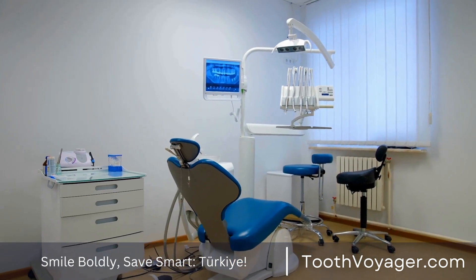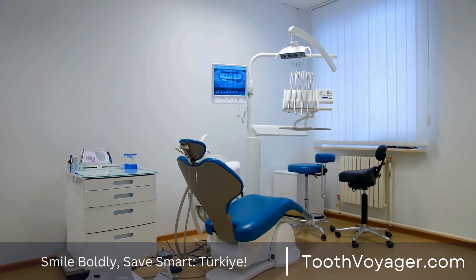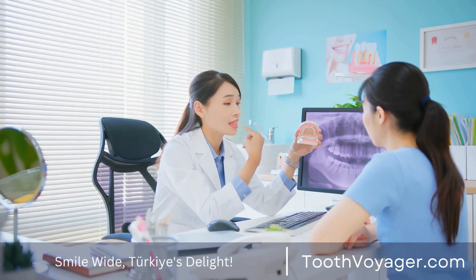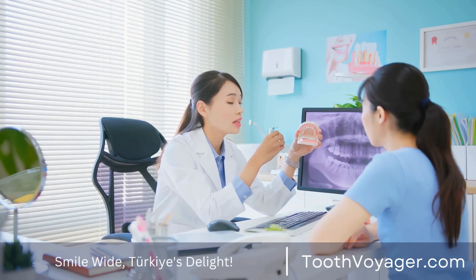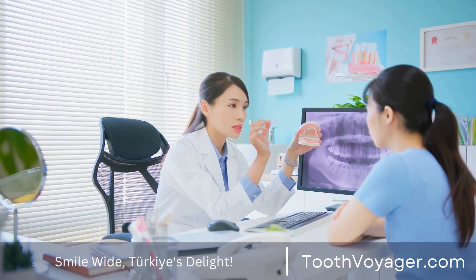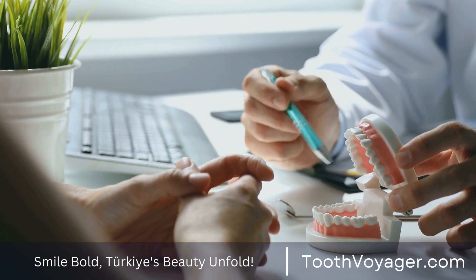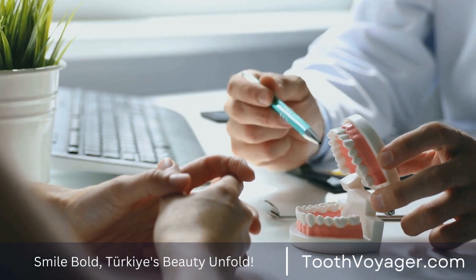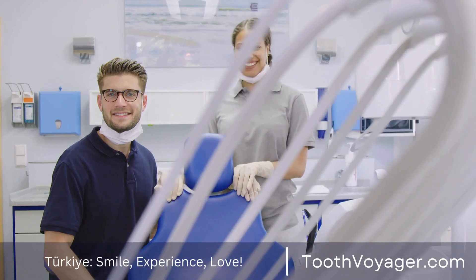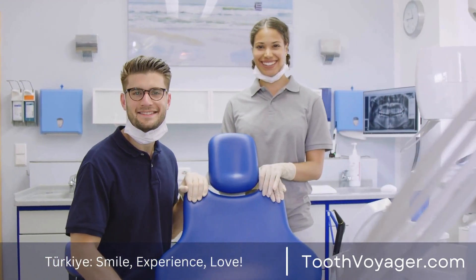The procedure of grafting bone for implant dentistry begins by conducting an extensive examination and analysis of the patient's oral health, as well as the jawbone's anatomy. When it's determined that it is needed, the dentist can discuss the different kinds of bone grafts available as well as the ideal option that best suits the individual patient's needs. During the procedure, the dentist makes an incision through the gum tissue in order to expose the jawbone, and the bone graft tissue is then inserted at the site where the dental implant will be placed.